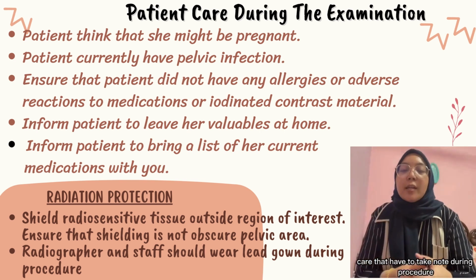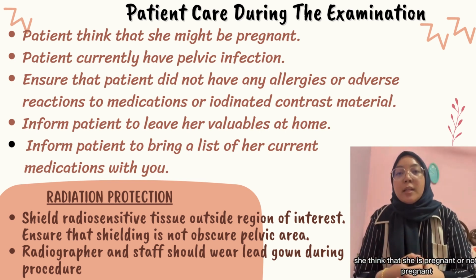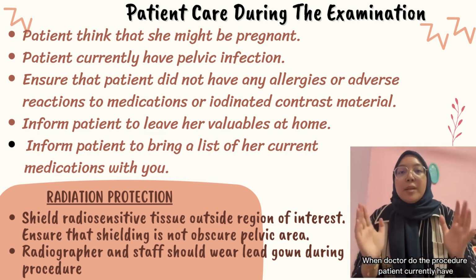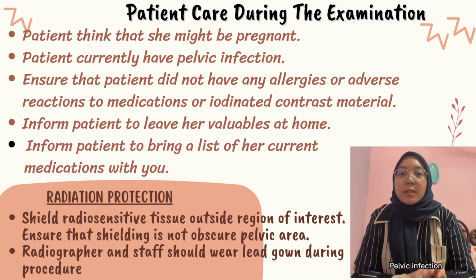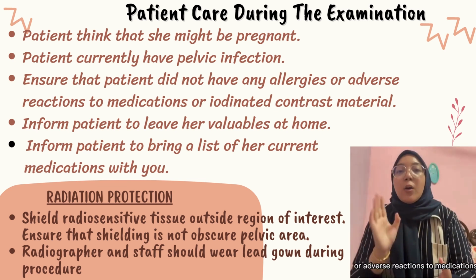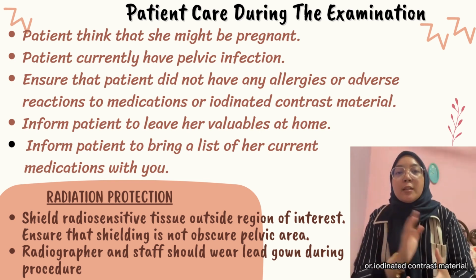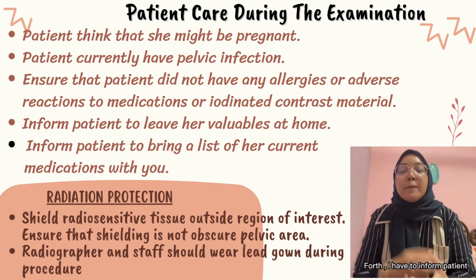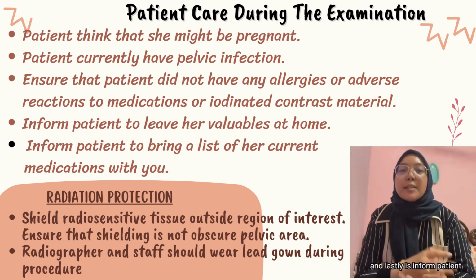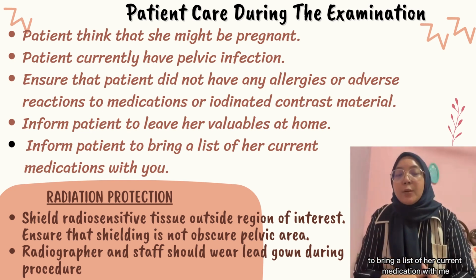So the patient care that I have to take note of during the procedure is, first, whether she thinks that she is pregnant or not pregnant. Second, when the doctor does the procedure, whether the patient currently has a pelvic infection. Third, I have to ensure that the patient does not have any allergies or adverse reactions to medications or iodinated contrast material. Fourth, I have to inform the patient to leave their valuable items at home. And lastly, inform the patient to bring a list of her current medication with her.